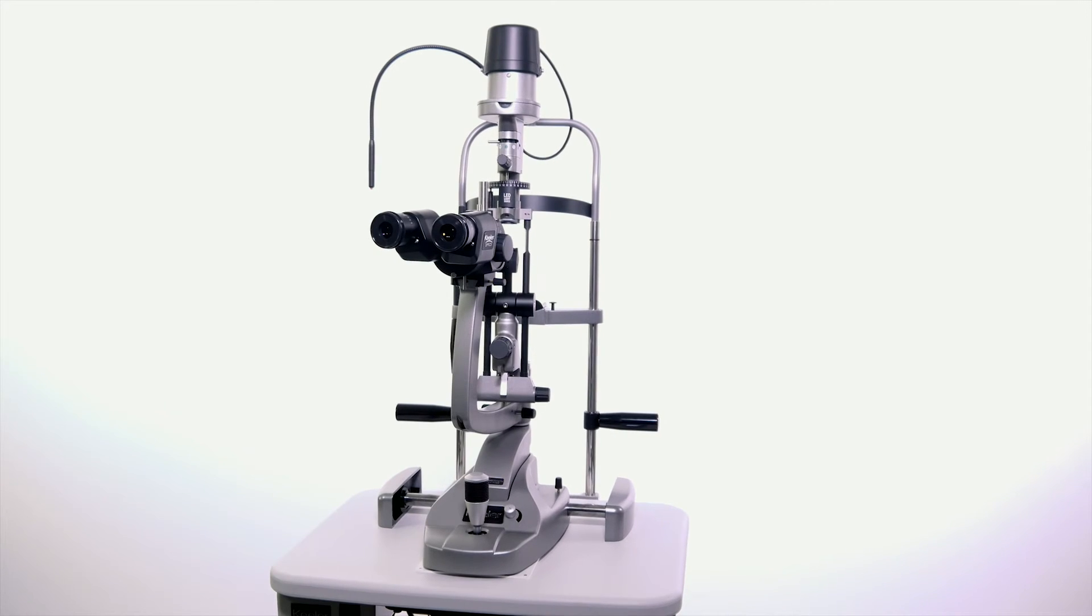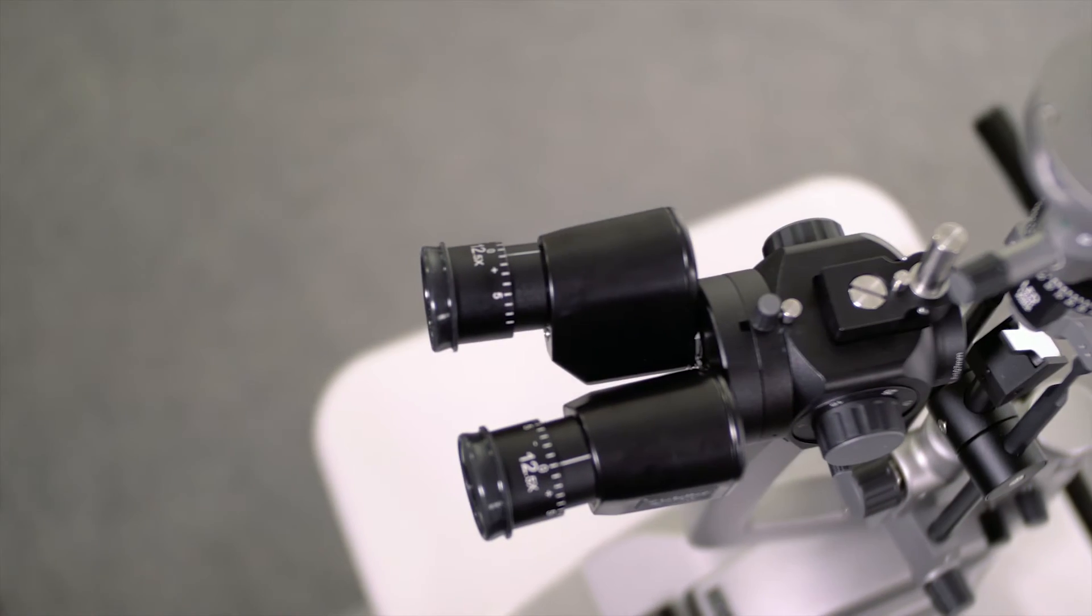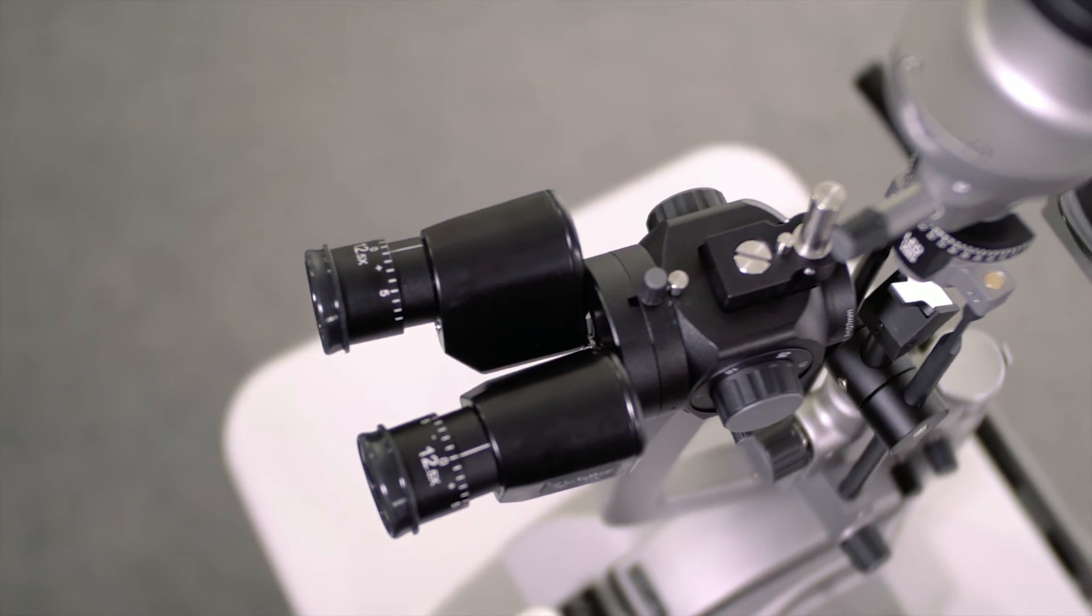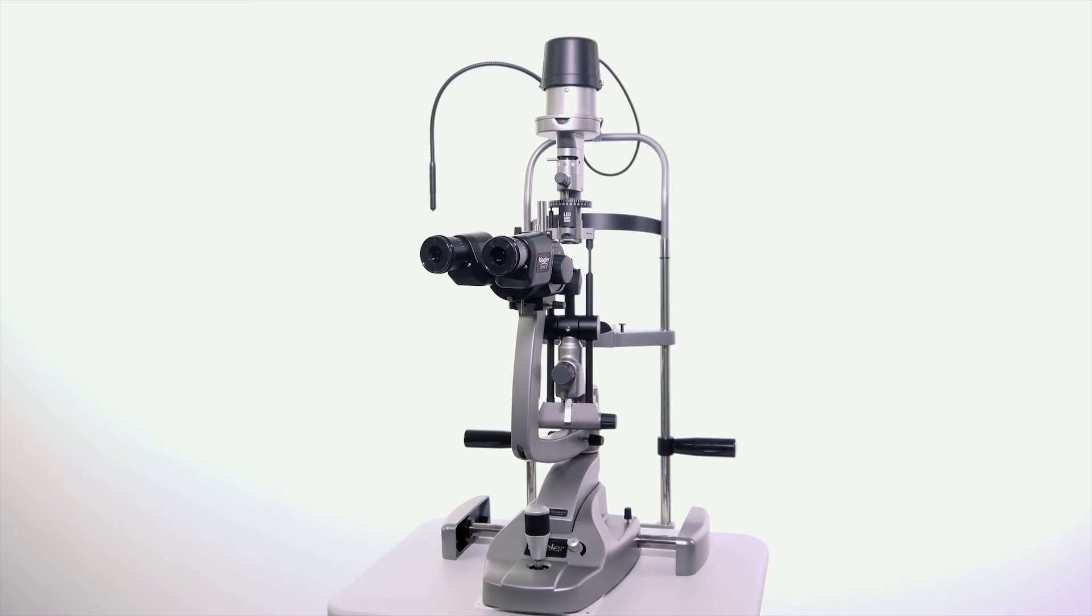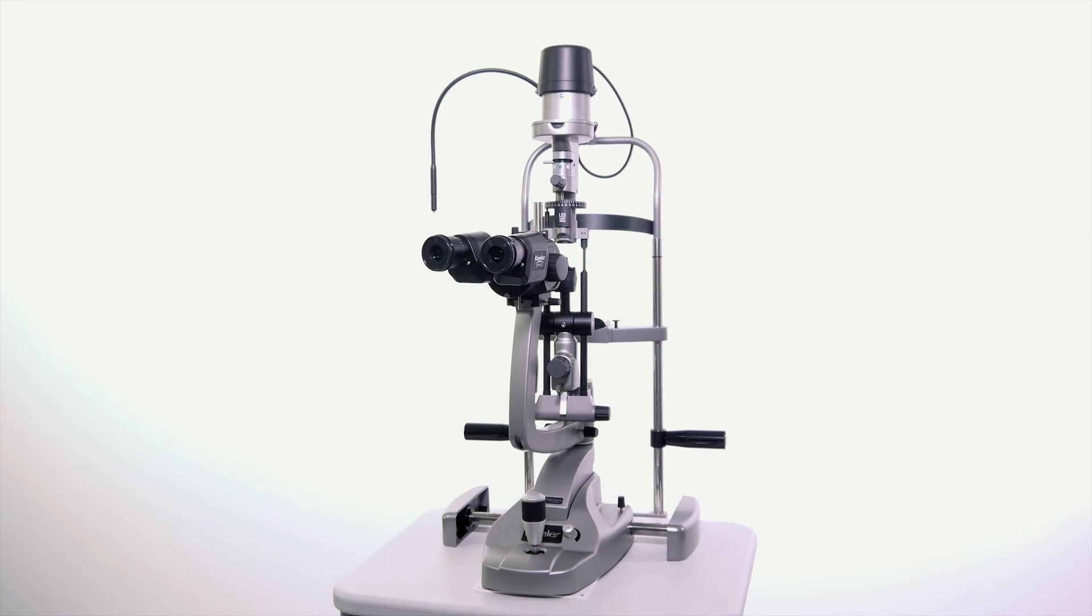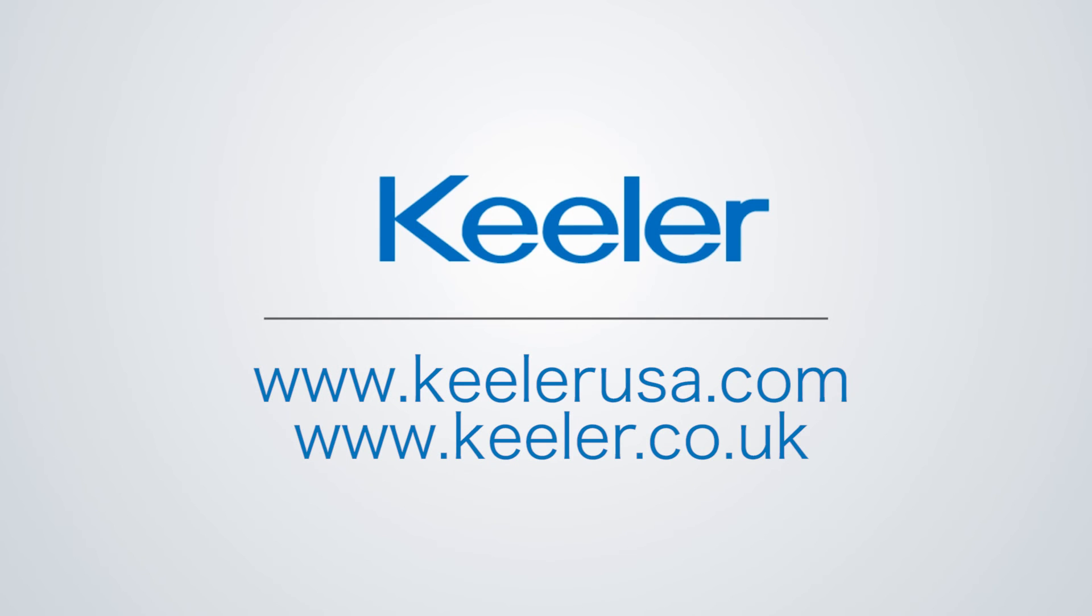The K-Series is our tower illumination slit lamp. It features a full range of features and K-Series exceptional optics. This product also comes in a digital-ready form that offers the same features but can seamlessly be upgraded to a full digital system. For more information about this product or other Keeler products, please visit our website.